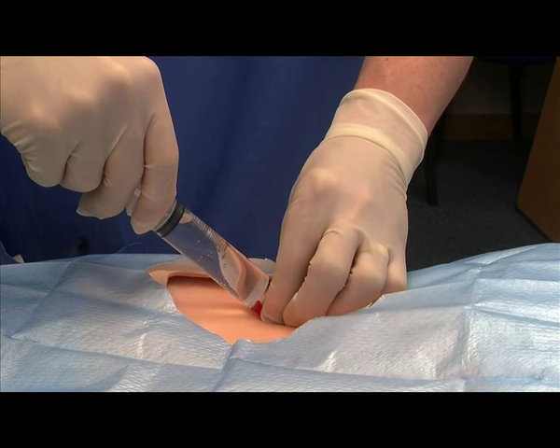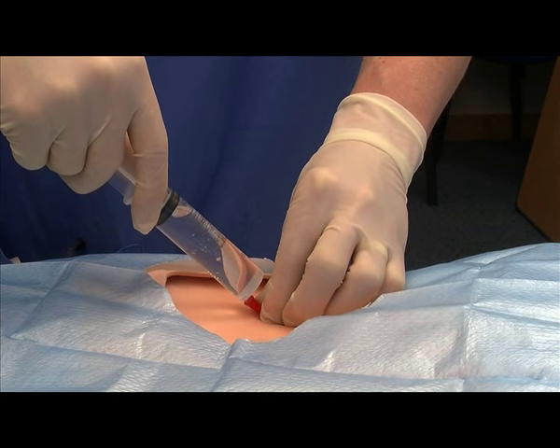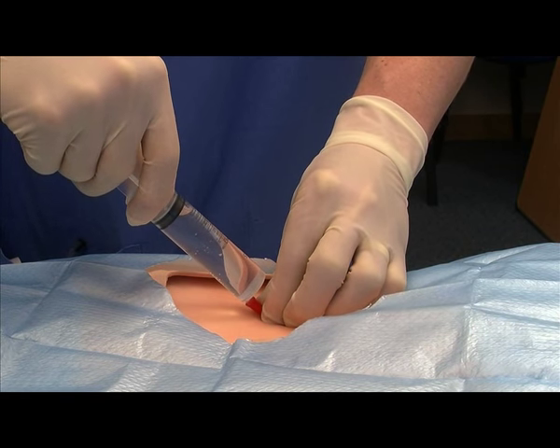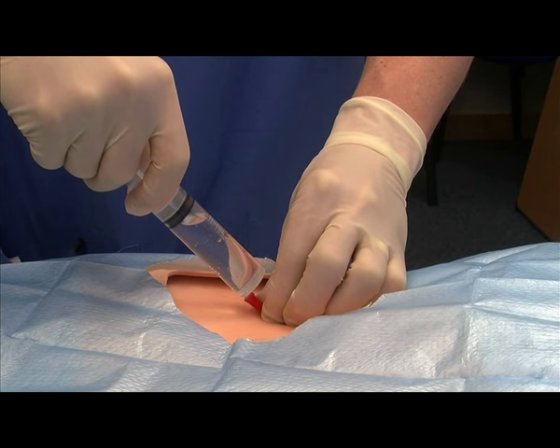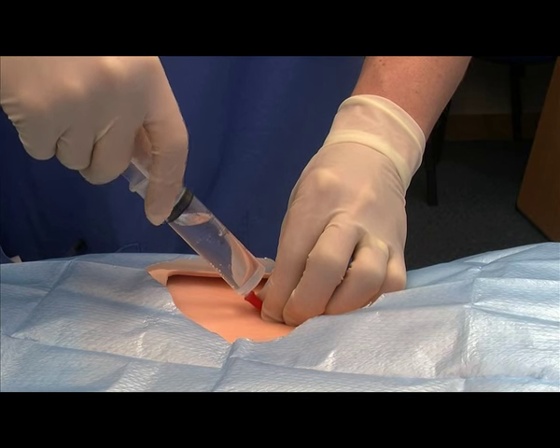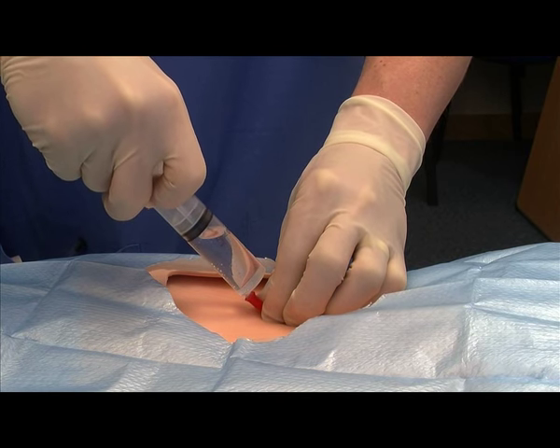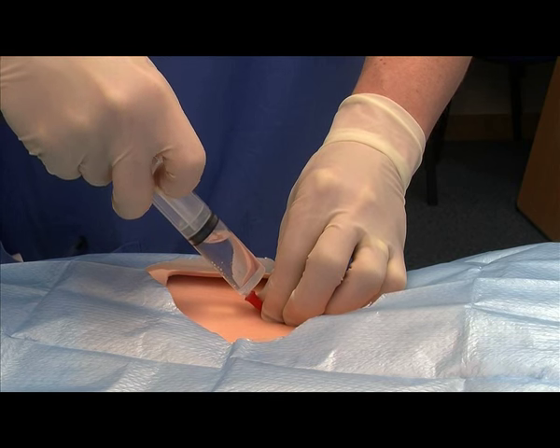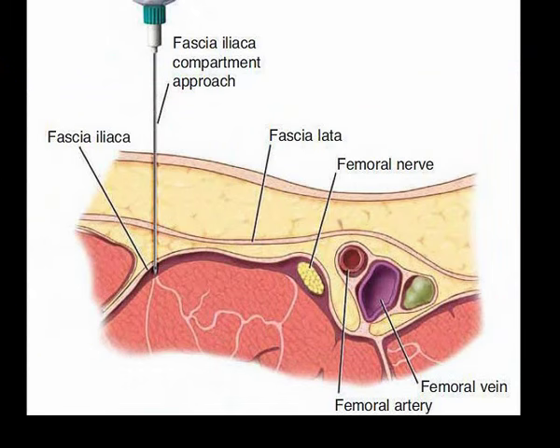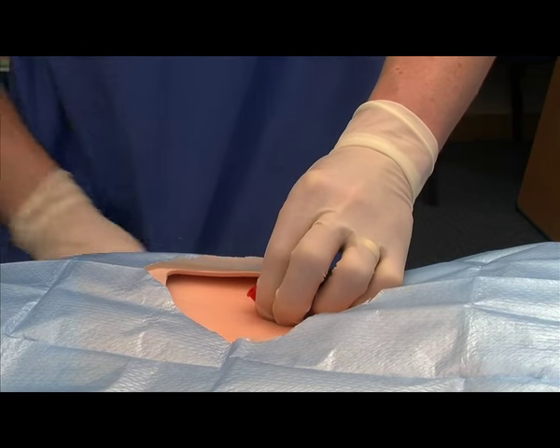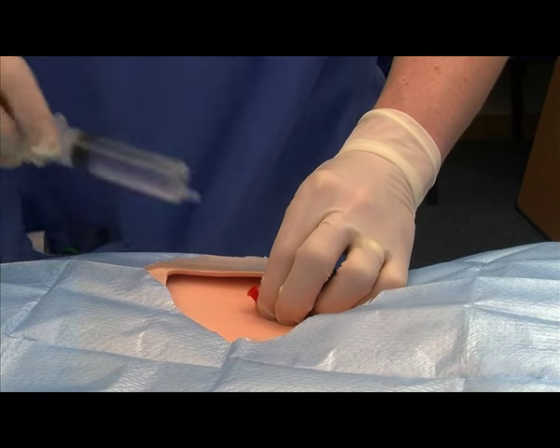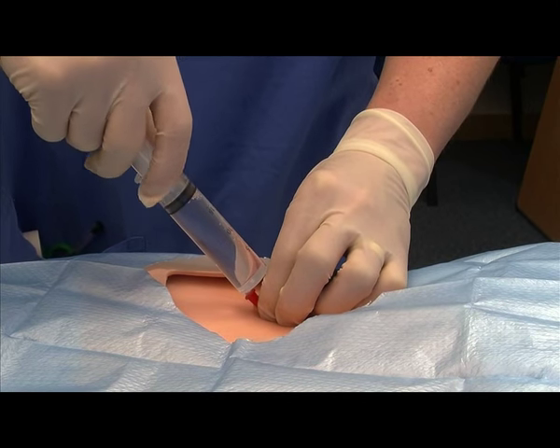Fix the position of the proximal plastic part of the needle securely with your non-injecting hand. Aspirate before injection and after every 5ml injected. If aspiration is negative, start injecting the local anaesthetic. There should be no resistance to injection. If there is, the needle tip is likely to be within the iliacus muscle — in this case, withdraw slightly until injection is easy. There should be no pain or paraesthesia on injection. After injection of the first 20ml, change the syringe and continue to inject the remaining volume. It is common to observe some of the injected fluid coming back through the needle during the change of the syringe.